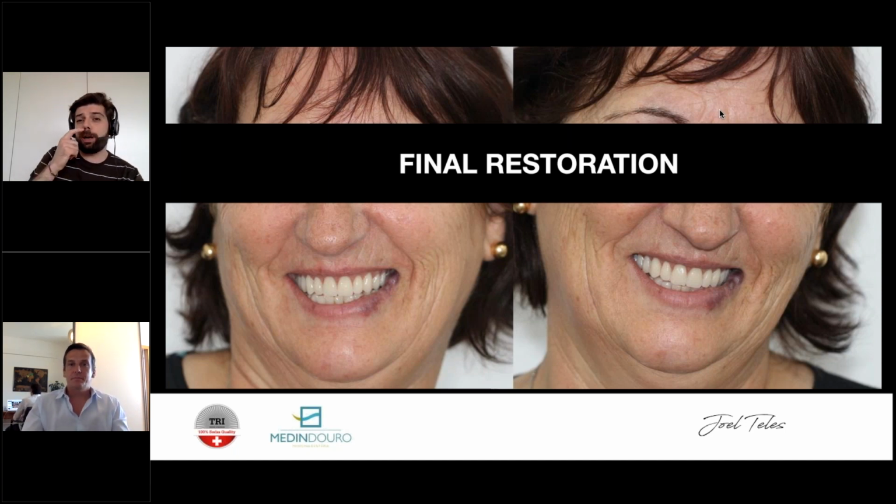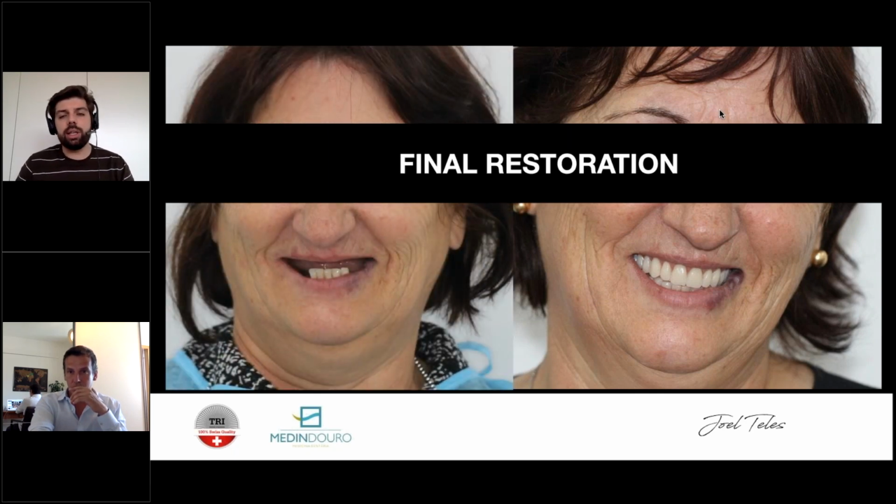Okay, so this is the final restoration. In these scenarios, I'll go for acrylic restorations. So this is a hybrid system with metal acrylic restoration. It's better, they're more forgiving, they're more elastic. And so this patient in 4 months' time went from this situation on the left to that situation on the right, in what I found to be a very tricky case with some things that were very difficult to correct. The lip movement was not good.